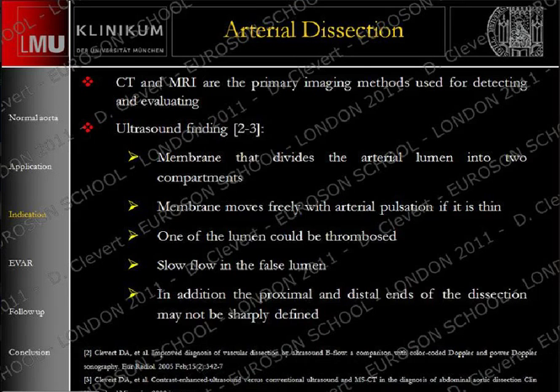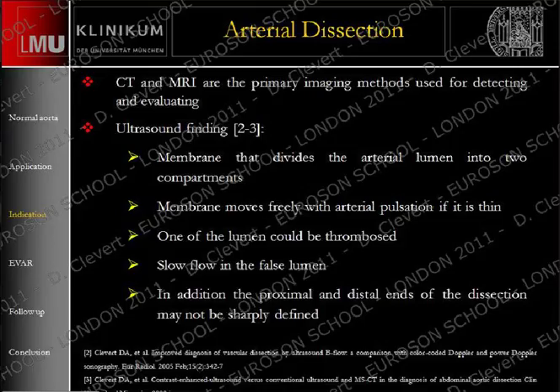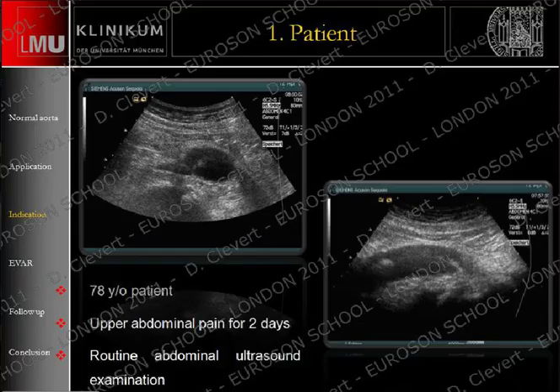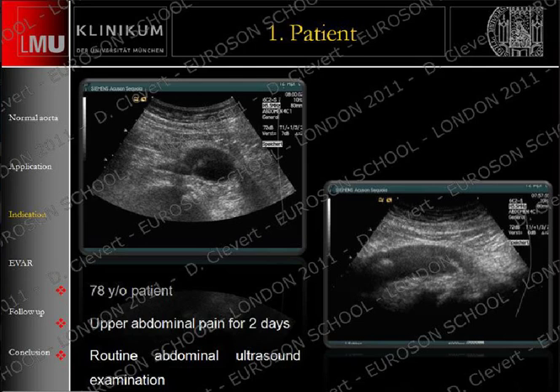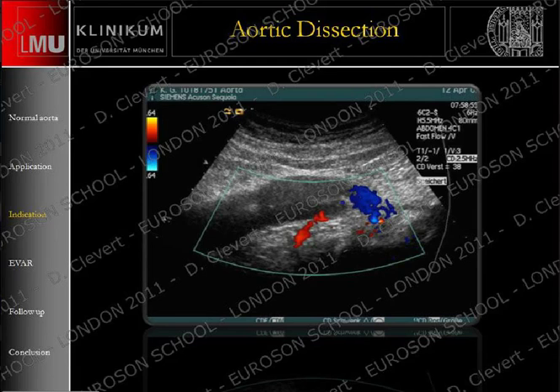If we speak about aortic dissection, we know that often we see the flap move in grayscale, but that doesn't always happen. If we want to follow up this patient, we want to know if both lumens have flow or if one is thrombosed, and where the entry from the renal artery is. In the easy case, you see the movement of the flap in the axial view and also the longitudinal view. By observing how fast the flap moves, you can identify the true lumen and the false lumen. With color Doppler we see different flow directions — here coded in red, here coded in blue.